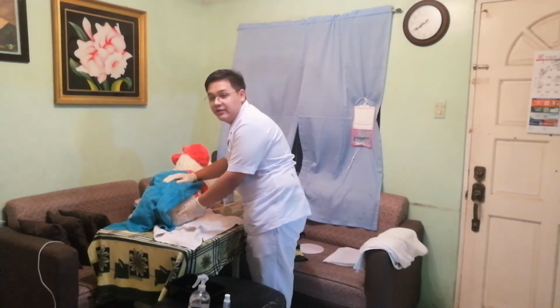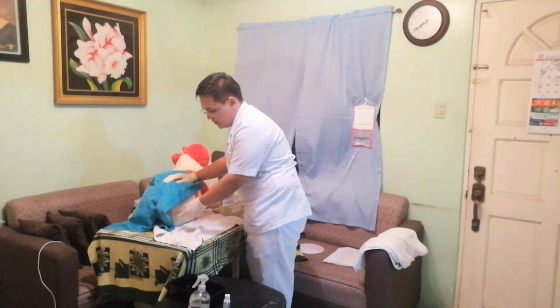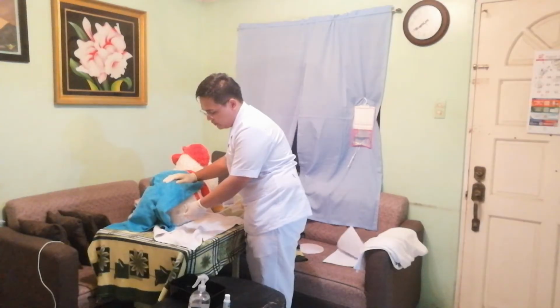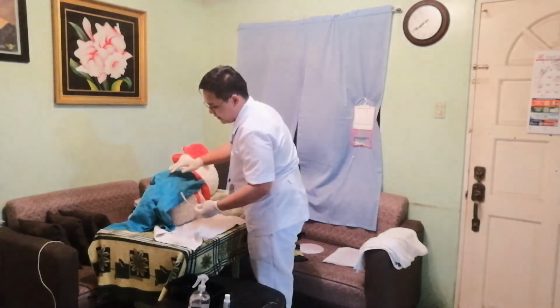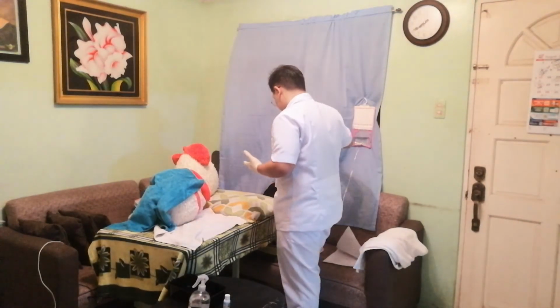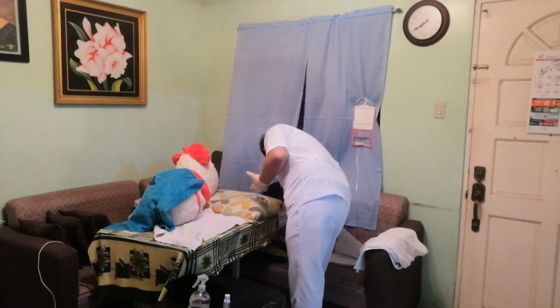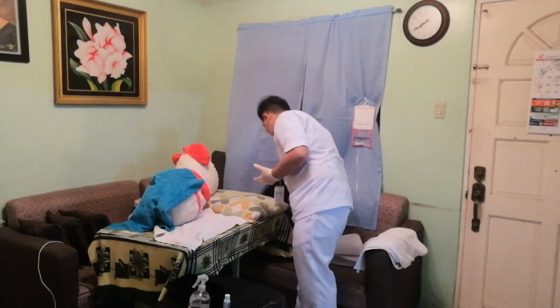We will now withdraw the tube using our hands. So gently pull the tube, okay. And after that, we will place the tube on the disposable paper as we withdraw it, okay.